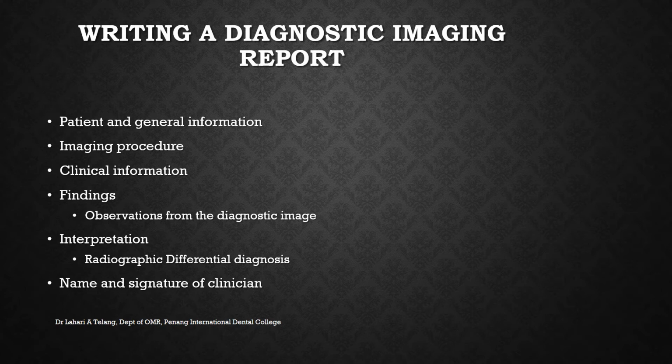While writing a diagnostic imaging report, these are the important points that need to be present in the report. First of all, the general information about the patient, what imaging procedure was done, what is the clinical information that is important to correlate with the radiograph, the findings that were seen, the observations from the diagnostic image, interpretation of the image, which includes what your thoughts are on the radiographic differential diagnosis, and lastly, the name and signature of the clinician.